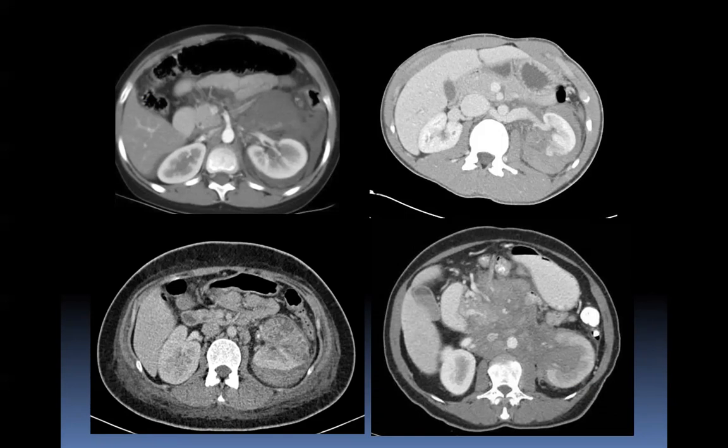So an easy way to remember is shattered kidney is going to be grade 5 when you have vascular injury. 4 is when you have injury to the collecting system. Okay. This one, yes, when you have injury to the collecting system.